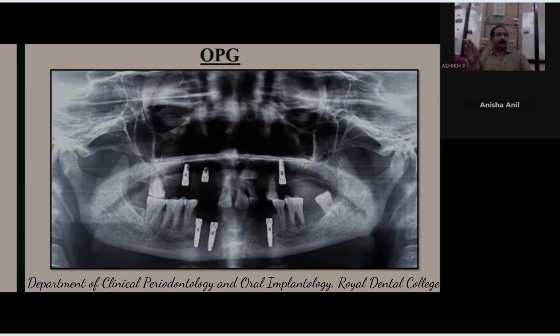So, if possible, you should be going beyond the 2.6, 2.7 region to rehabilitate it with the maximum span. That will give a better occlusal harmony to the patient, right? Because there is 1.7 or 1.8 still in the first quadrant region, right?